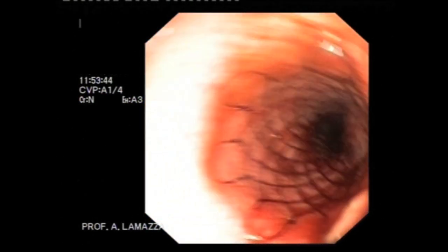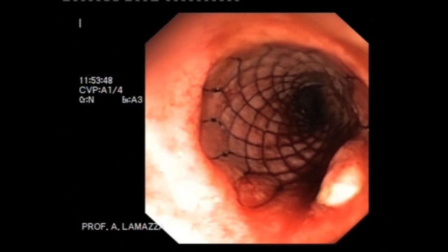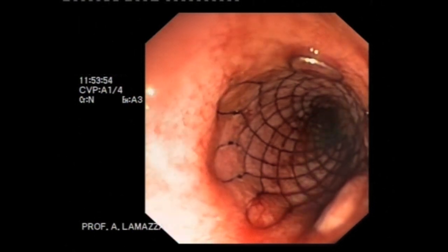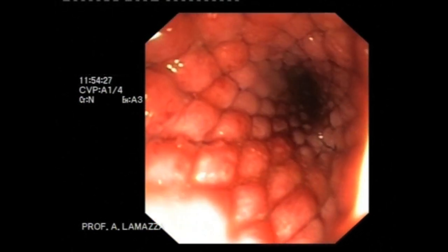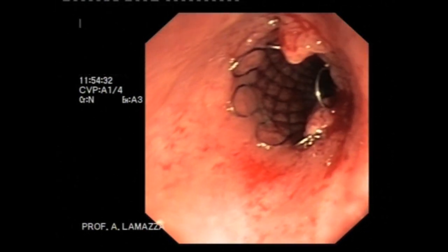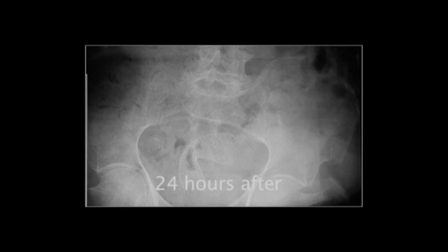The correct position of the stent is confirmed radiologically. The colon scope is advanced through the stent up to its proximal margin to verify any possible kinking. At the end of the procedure, an abdominal x-ray is performed. The stent has usually an hourglass shape; it will take at least 24 hours before the stent is completely expanded.